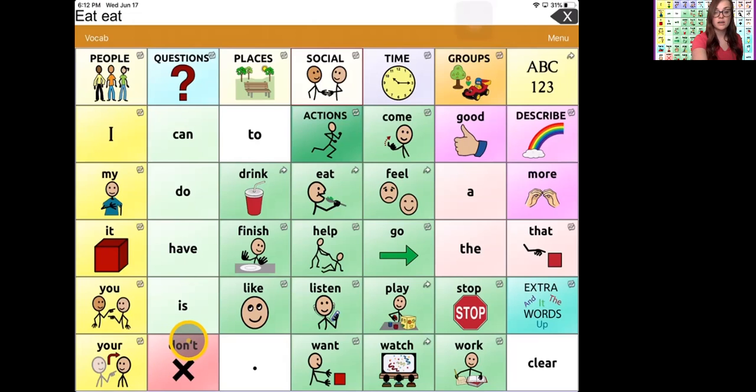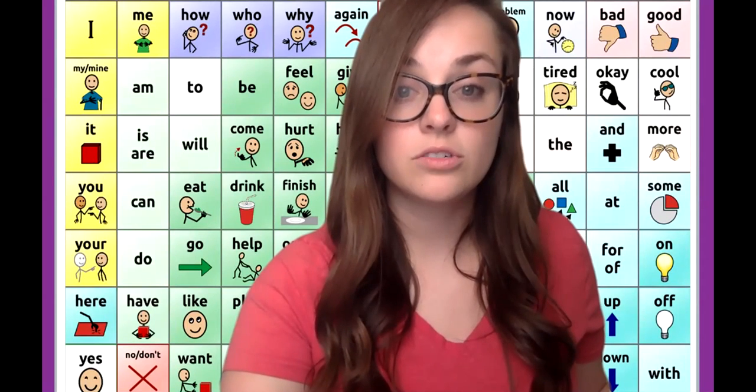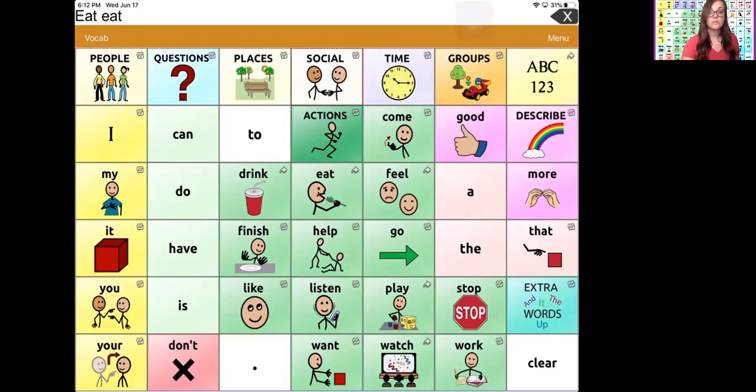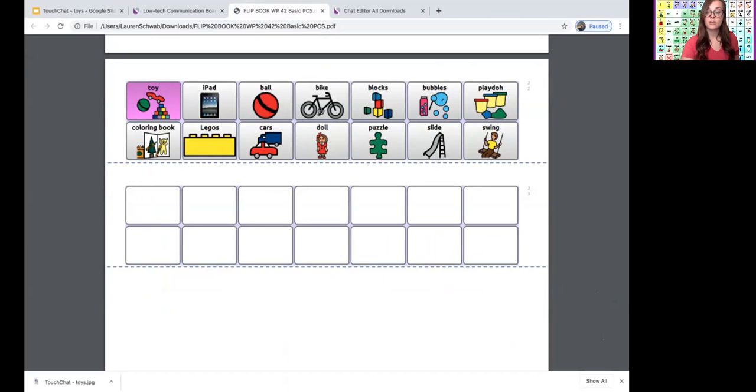Another way to share or to model would be to simply share that flipbook in a low-tech manner instead of doing it via green screen. So now I'm going to show how I would do that with a few tips. I would just go to my flipbook. My biggest tip here would be to use the annotate function, use draw, and select a circle.